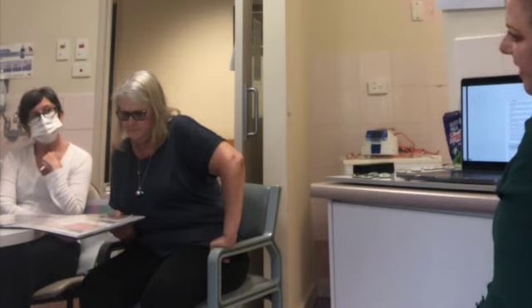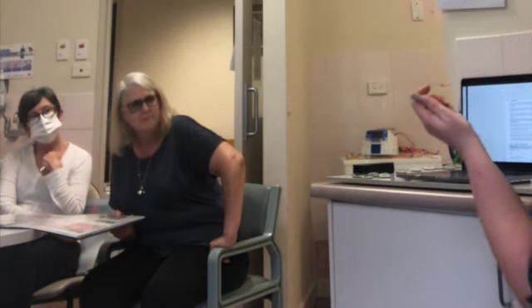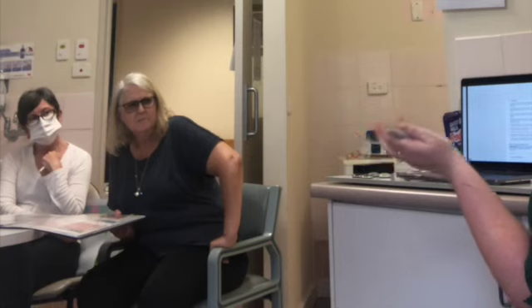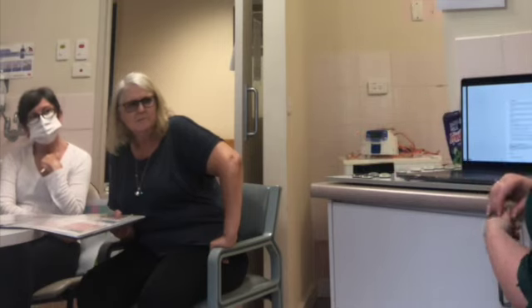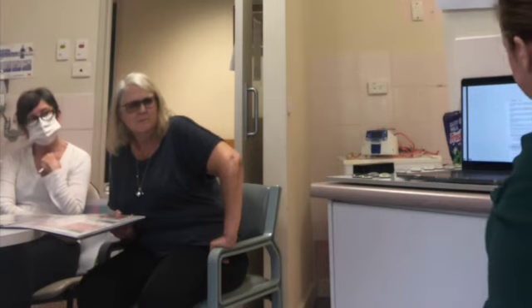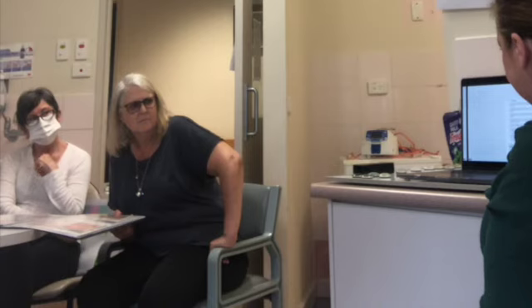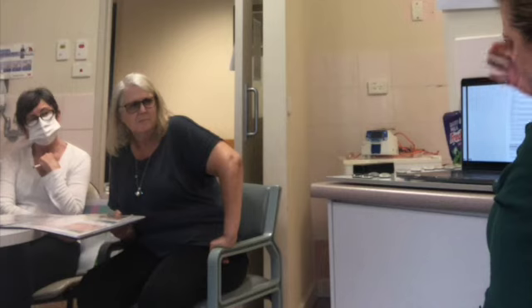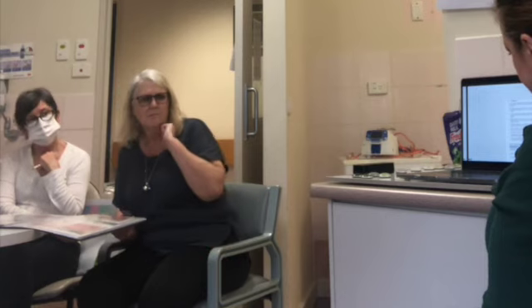We're all guilty of it. I think it's something we could do a bit better. Particularly in ED, I've found if there's an IV pump, I think I did it the other night with you, Janine, that's pumping and alarming and occluding, have a look at your dressing. Maybe a dressing change can stop it. If it's moist under there, there's also a section in here where you can use sterile gauze to help soak up some of that. But there are very strict conditions, so every 24 to 48 hours that gauze needs to be changed under the dressing.